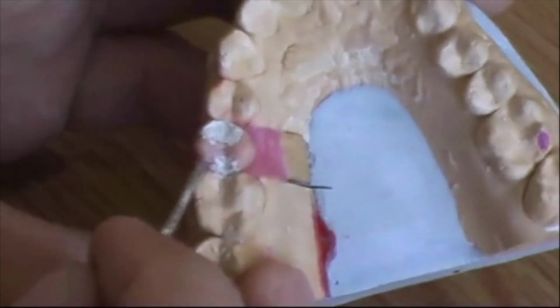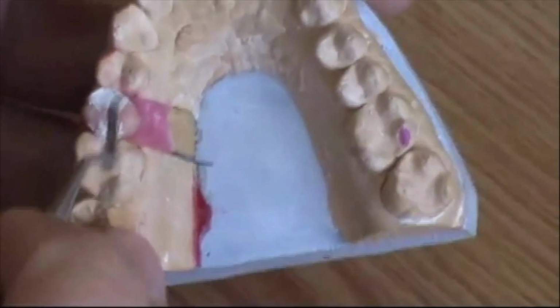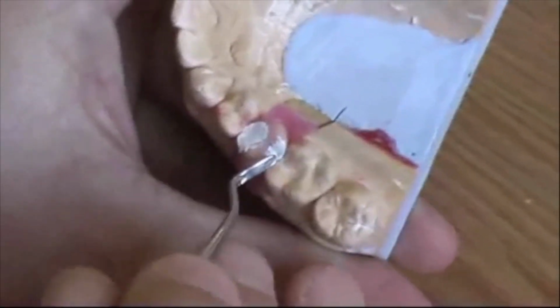And the important thing is to copy this morphology, because this morphology will be copied with CAD/CAM techniques up to the end. So the patient will have a restored tooth that will be identical to the original. That's the level of precision that we want to work with now. Of course, when you do this, you can use some water, or the best thing is to use a little bit of saliva. There's always some around, so you don't have to buy it.